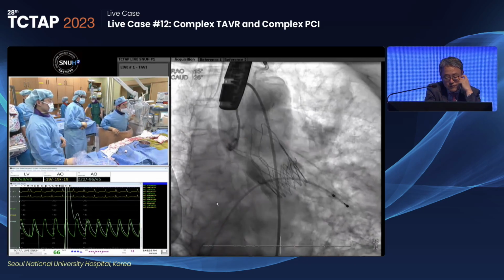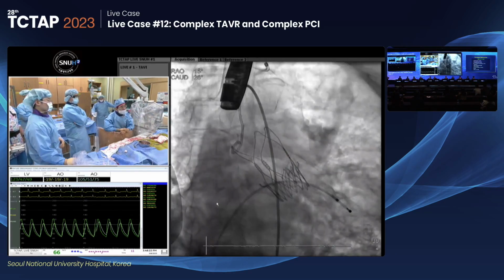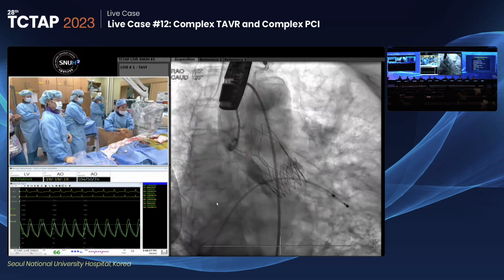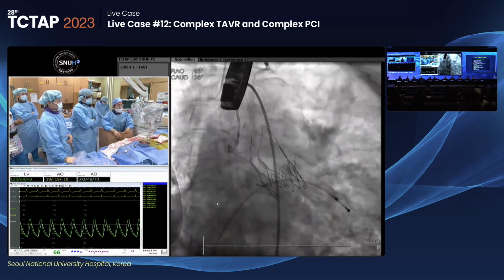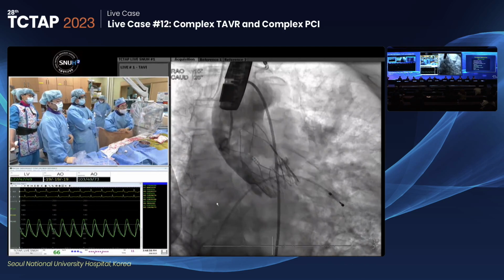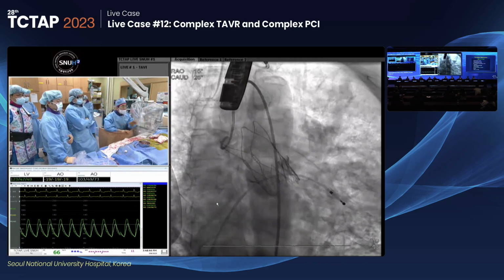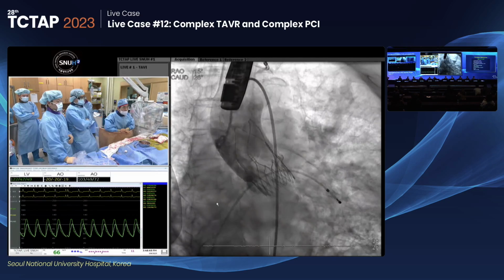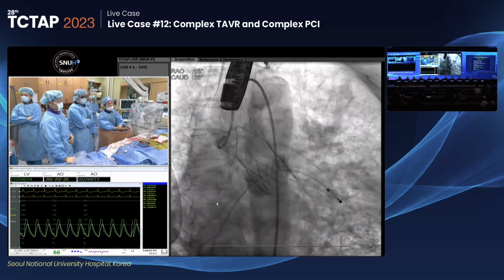I was curious about the reason for paravalvular leakage, because the oversize index is full and the valvular calcification is really little, no heavy commissural calcification. But what's the reason for such trivial paravalvular leakage? Wrong calculation of annular size? This is contrary to my expectation. I expected perfect, no leakage, based on my previous experience with Accurate. But there is a trivial regurgitation leakage here. I don't know the reason.